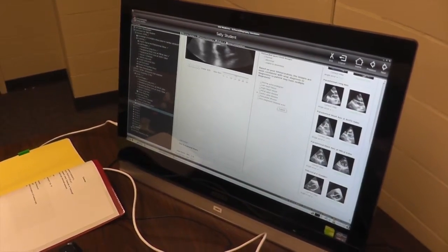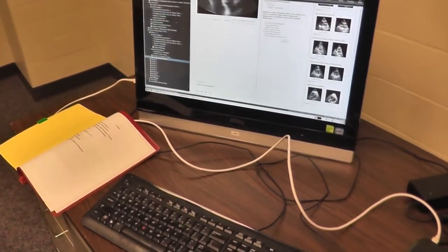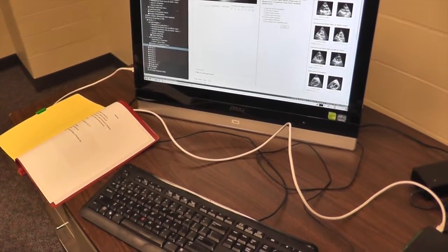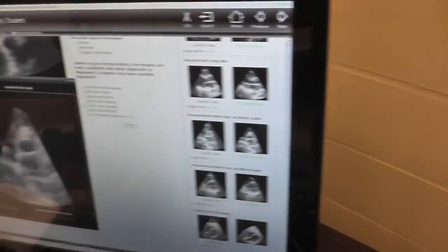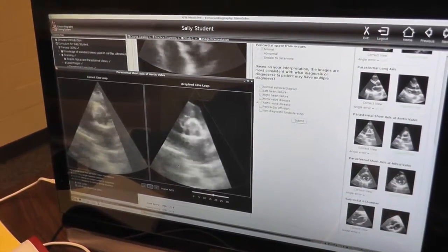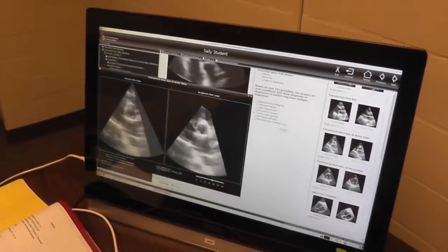Under discussion in the middle panel, there is a brief amount of information on the diagnosis. The second thing you can see now is all of the images that you acquired on the right side and the corresponding optimal view on the left side. If you click on any of these thumbnails, you will bring up again the dual display together with the angular deviation, which shows you how close you were to the correct view.